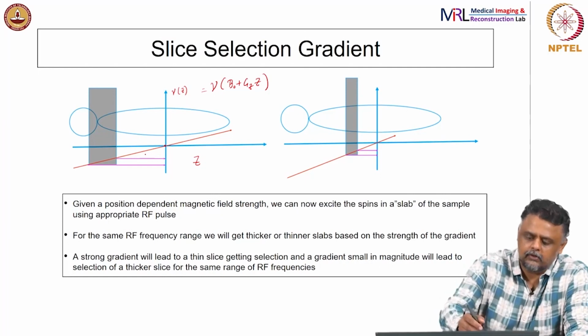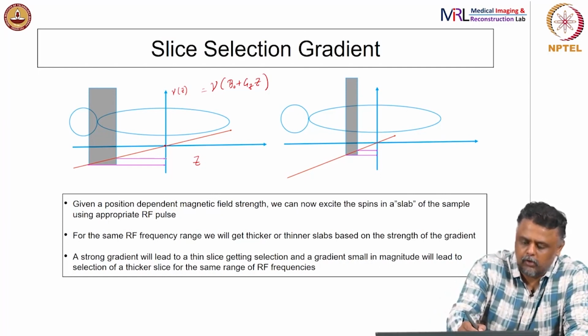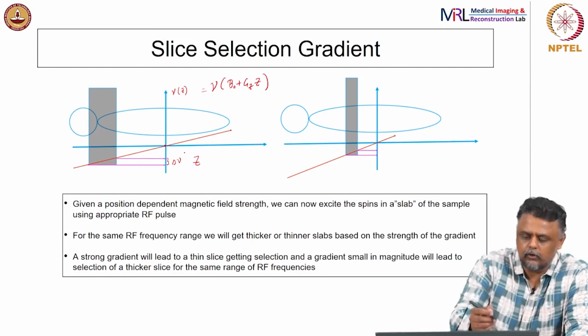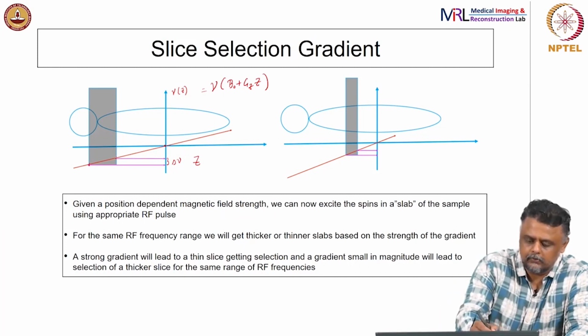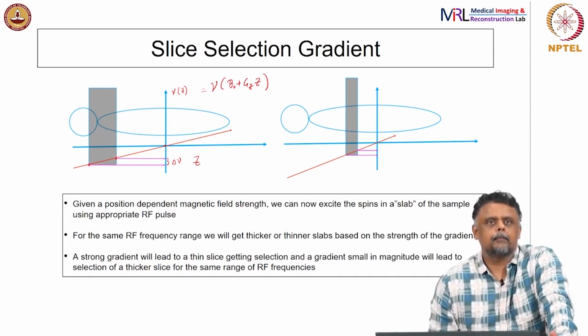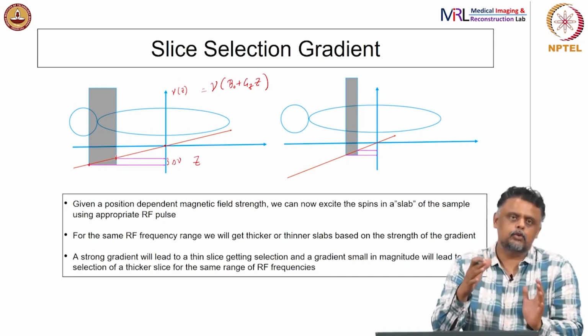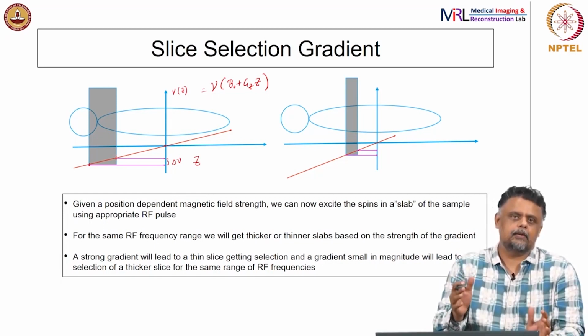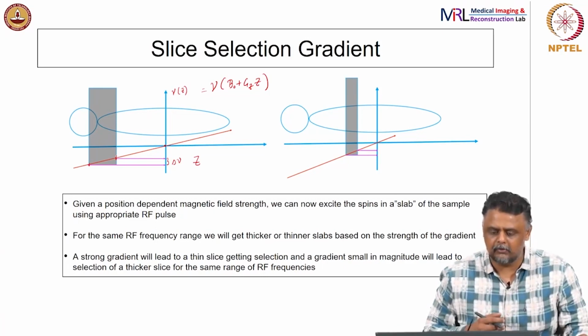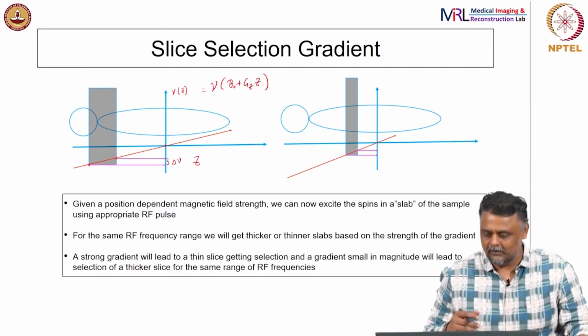Now, what does it do? Because it is shallow, going a small delta, this is the delta precession frequency, and that leads to a very wide slice, correct, because the gradient's amplitude is small. A very thick slice of tissue will have spins with pretty much the same precession frequency. So, that is what that formula also tells you. Okay. So, my nu and gammas look the same, sorry about that, but you have to just understand that part.